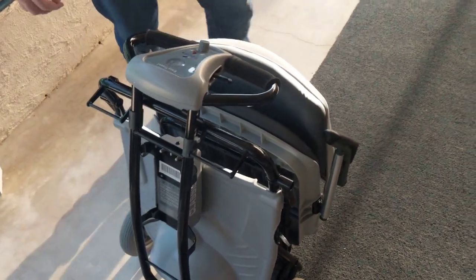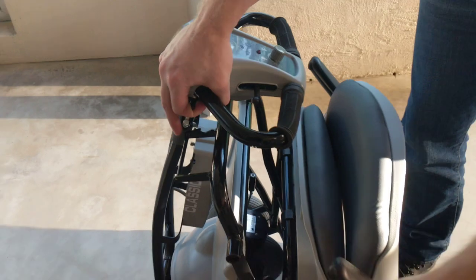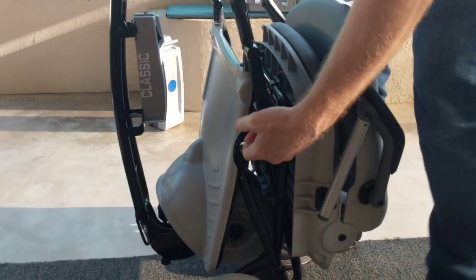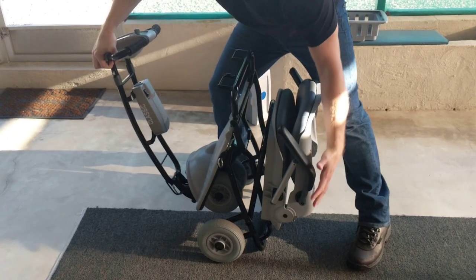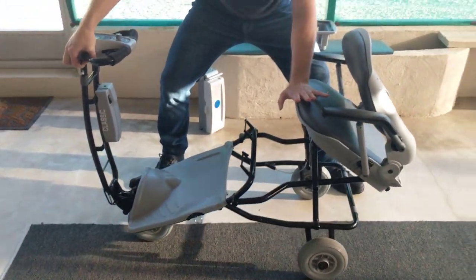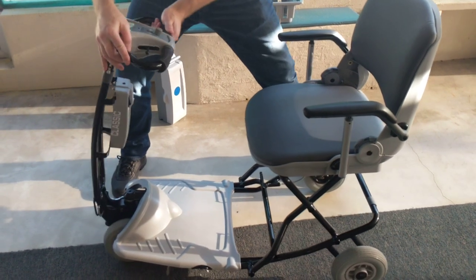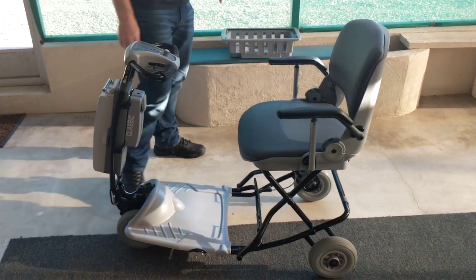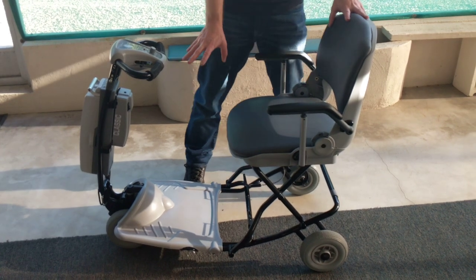Unfolding the device requires a couple of steps. Disengage the steering column, disengage the rear part of the scooter, and let the scooter wheels make gentle contact with the ground so you can start to roll the scooter back. Disengage here, lock the seat in the back position, and you're ready to put the battery back on. You can see I stayed standing up the whole time — with just a little bit of effort, it's very easy to open the Lexus Light.